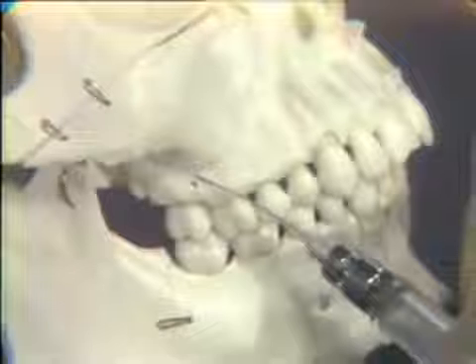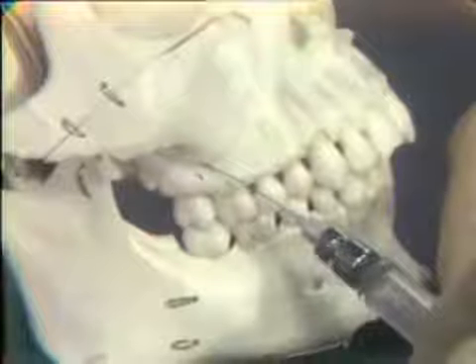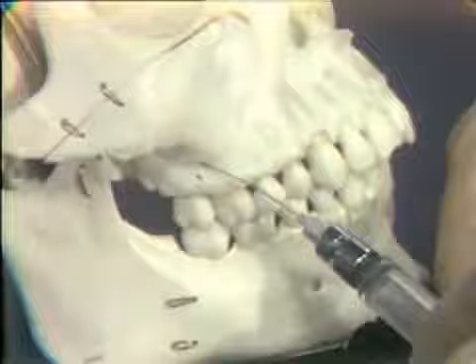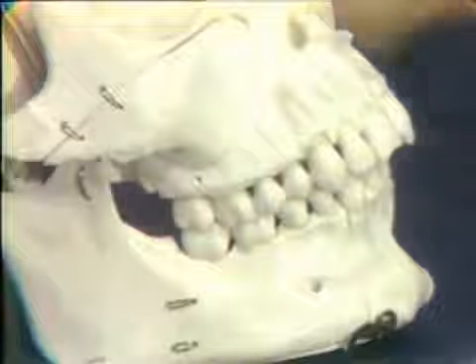Injection slowly after aspiration of approximately 2 cc's of solution. For those of you that are using carpule syringes, your maximum dosage for each injection is 1.8 cc's, but that should be adequate. And then out quickly. All right, let's demonstrate it on the patient.